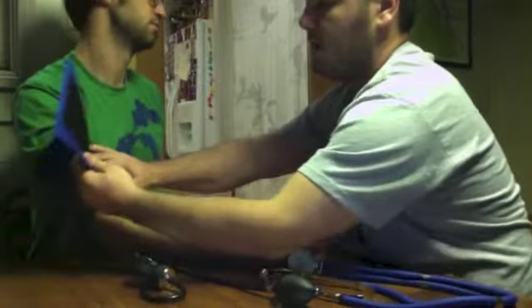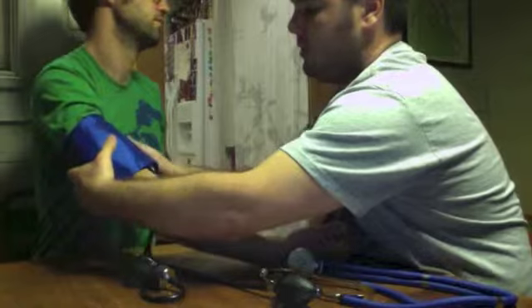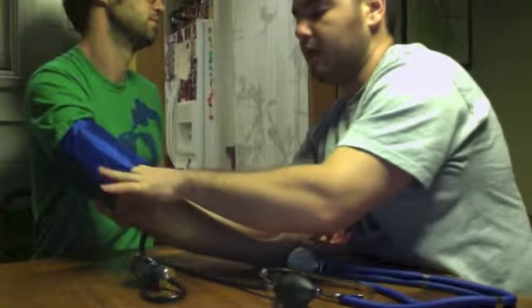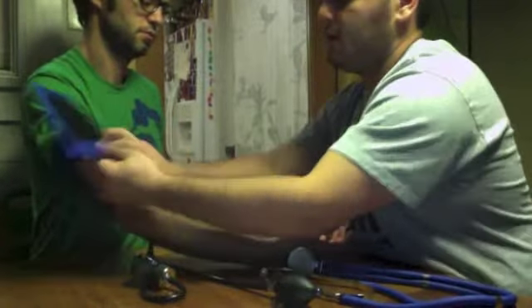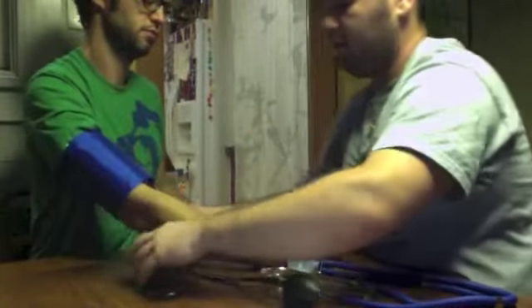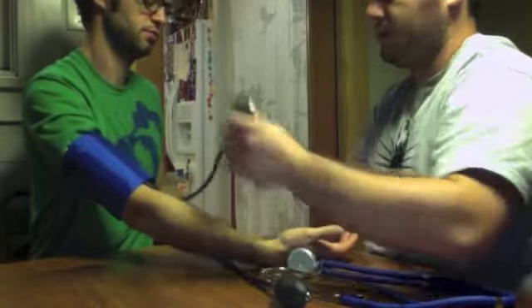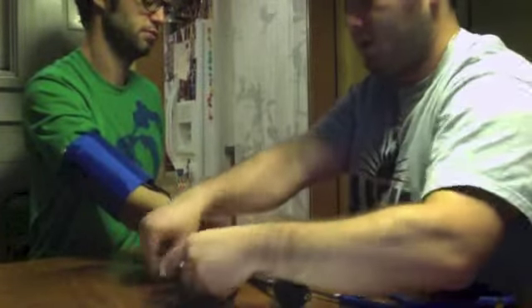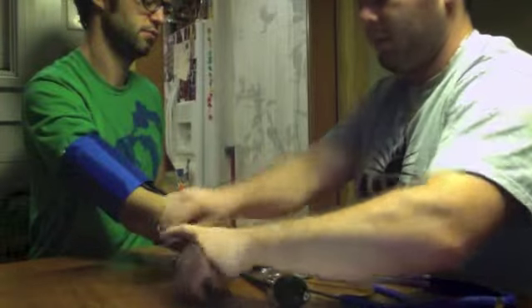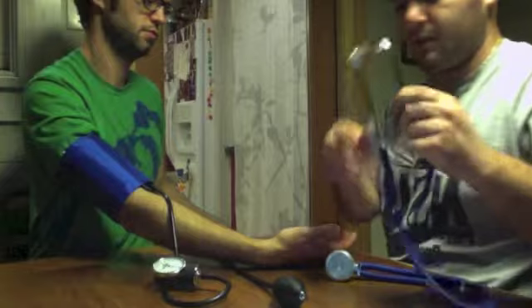I want to make sure it's not so tight. And we also want to give a 2-finger check just to see what that is. So that was a little loose there, so I'm going to tighten it just a little bit more. Good. So what I'm going to do here, I'm going to place the blood pressure reading here. I'm going to put on my stethoscope.